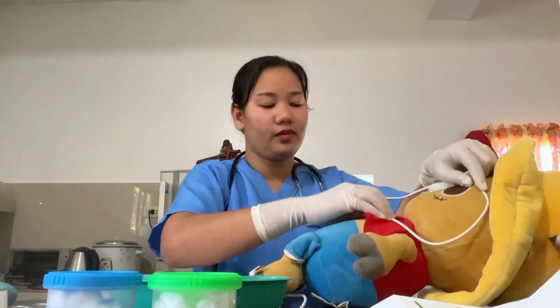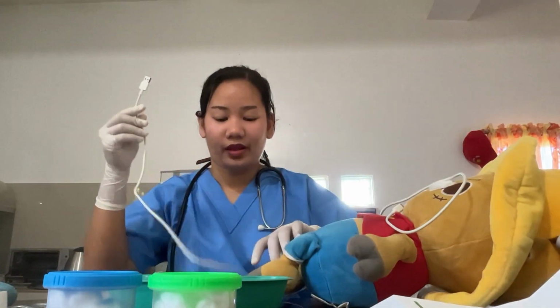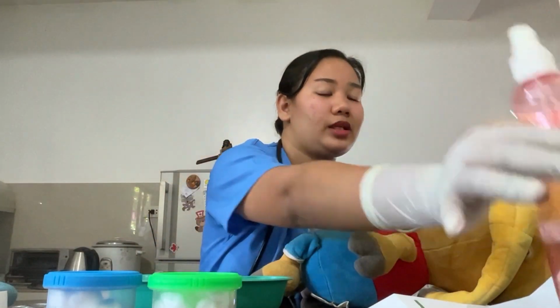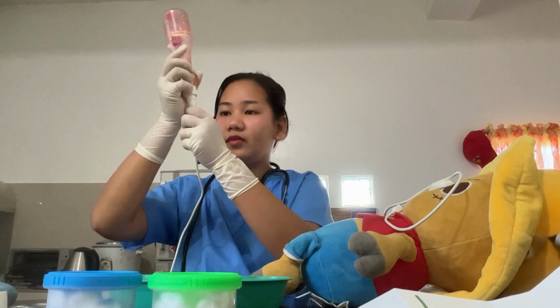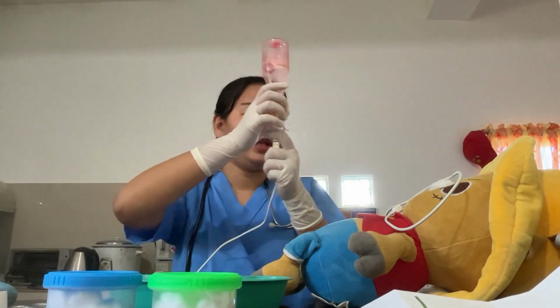And after that, I will attach this tube to a suction source or feeding apparatus. So let's assume that this is a feeding apparatus. So I will attach this. Okay. Then I will secure this tube to the client's gown.